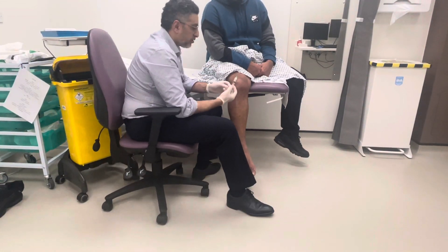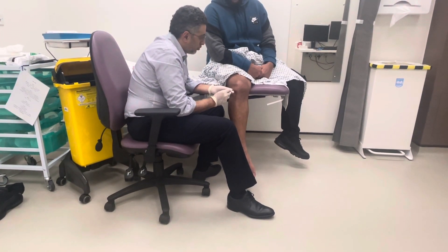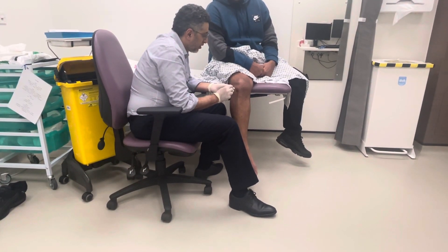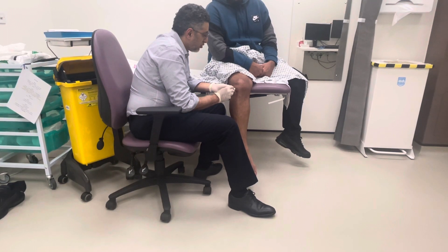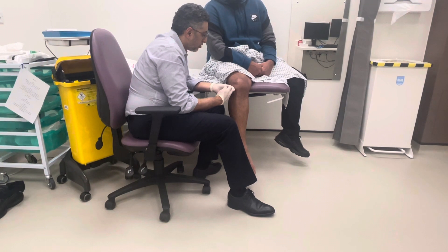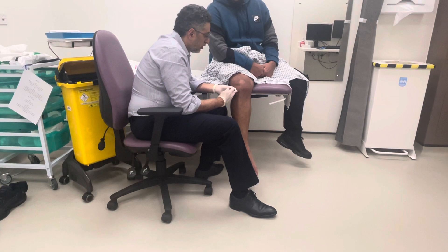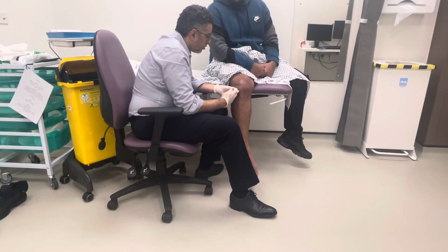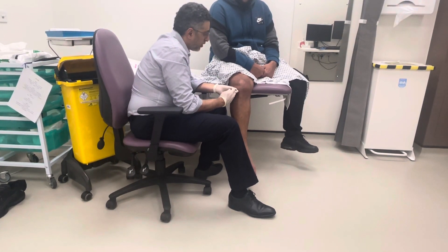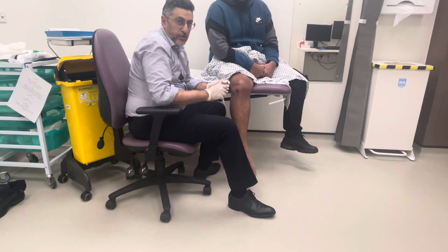I'm going to give now the steroid injection. Small scratch — he shouldn't feel pain now, just feel something going in. You can see that he's not jumping like he did before. And now I'm going to give the injection and it's going in easily. You're okay — you'll feel some pressure there. And that's it, thank you very much.